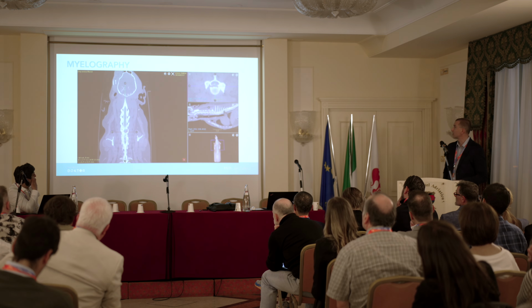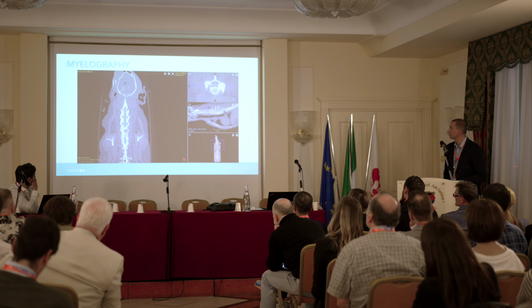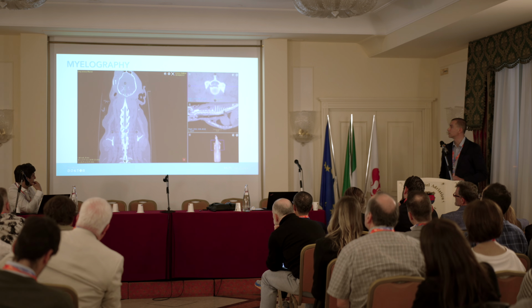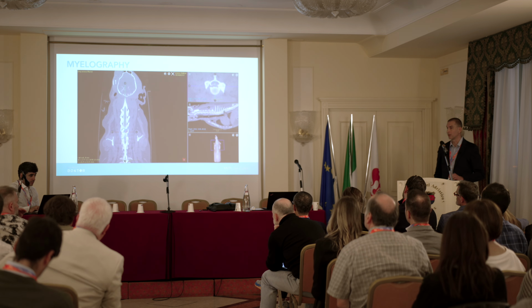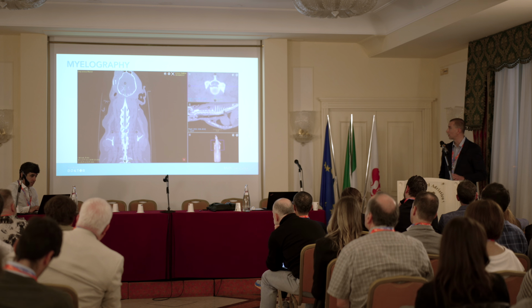So other projections or other parts of those imaging, there is a big hole here, so that it's extruded this material which we have to put it out surgically.